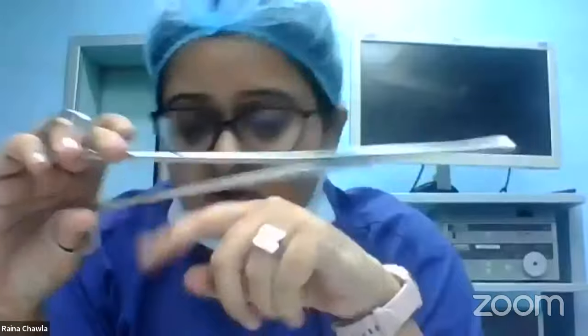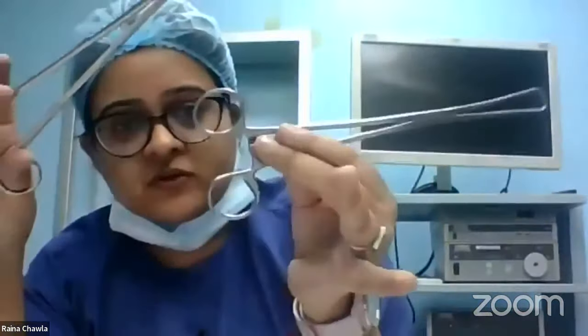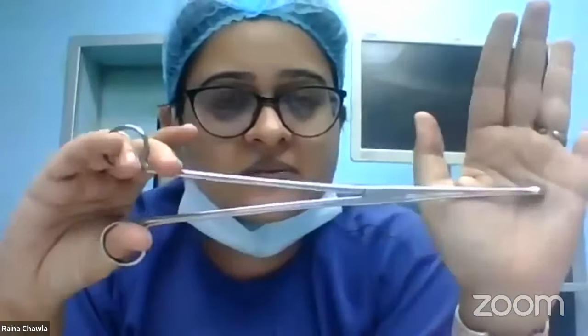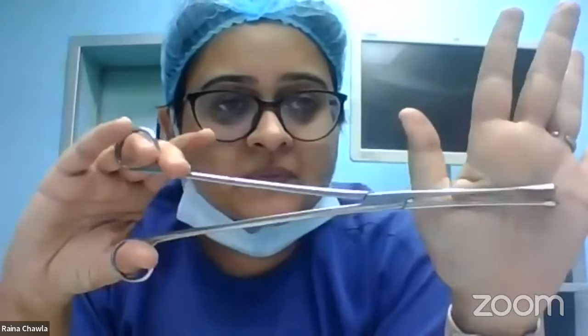See here, there is no lock. All other instruments which I've shown till now have a lock. Most other instruments which I'll show you further also have a lock. This doesn't have a lock. Why? Because we want free mobility in removing the products of conception. Also less trauma when we close the lock.